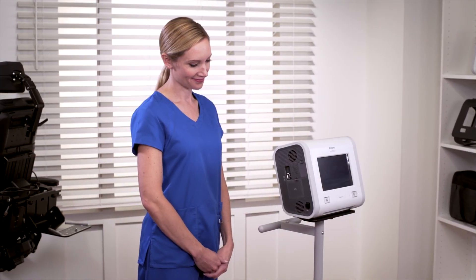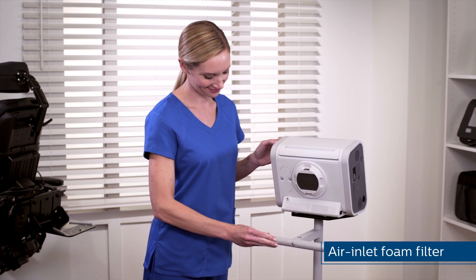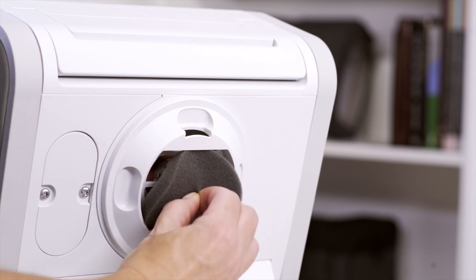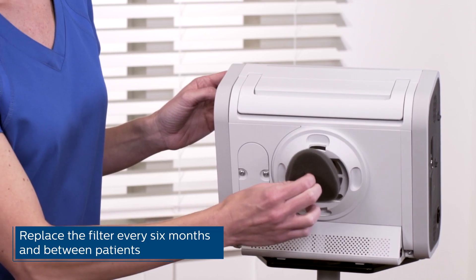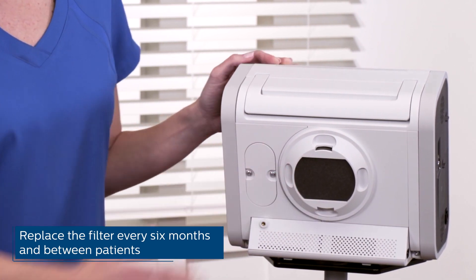Whether stationary or mobile, protect Trilogy EVO from dirt and dust with a disposable air inlet foam filter. To remove the air inlet foam filter, pinch and pull. To insert, place the filter into the filter cover and position it securely behind the top and bottom restraints.